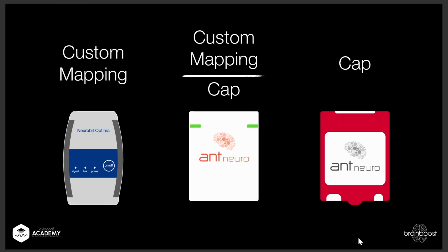Now, the word mapping. Some people are new in the webinar today, but I talked about mapping in some former webinars. Once in a while, I like to address that. I will explain this for some people that are not aware of what I mean by mapping.